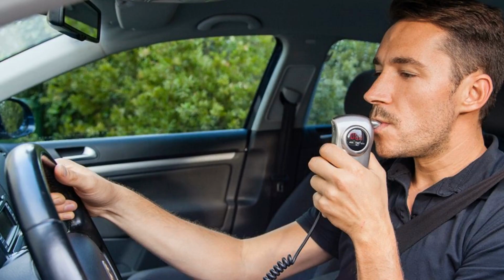Principle of operation and instructions for use of the device. Not all people know how a breathalyzer works. When alcoholic beverages are consumed, the liver secretes the enzymes necessary for its processing, which also results in the formation of acetaldehyde. The decomposition product through the bloodstream is sent to the lungs, and from here it is already completely excreted from the body. So, the principle of operation of the breathalyzer is in the accurate calculation of the amount of alcohol in the body.